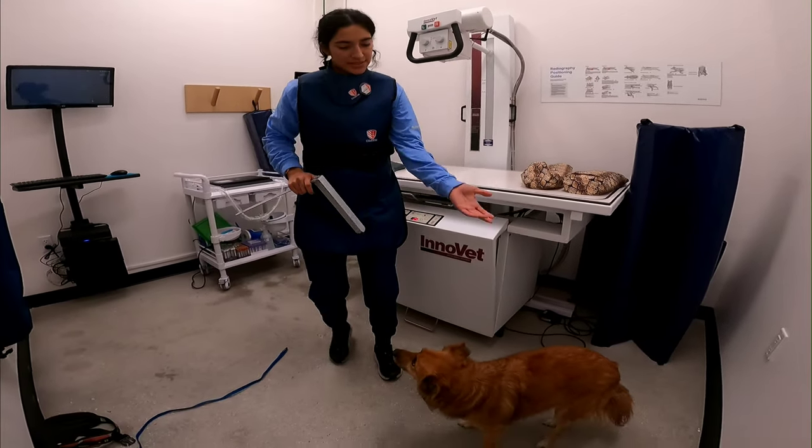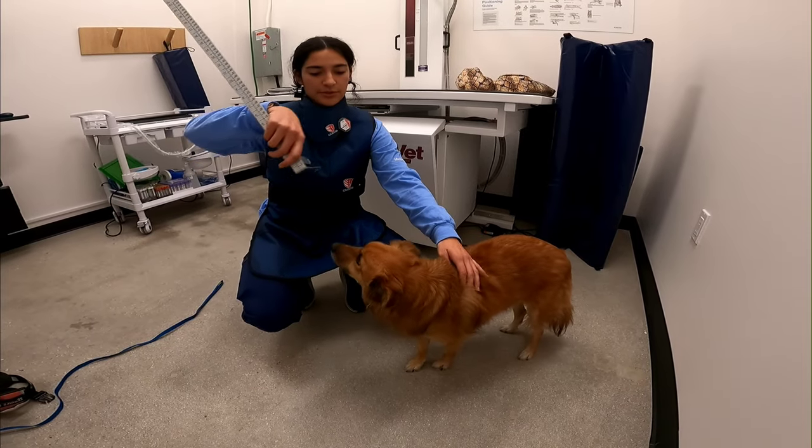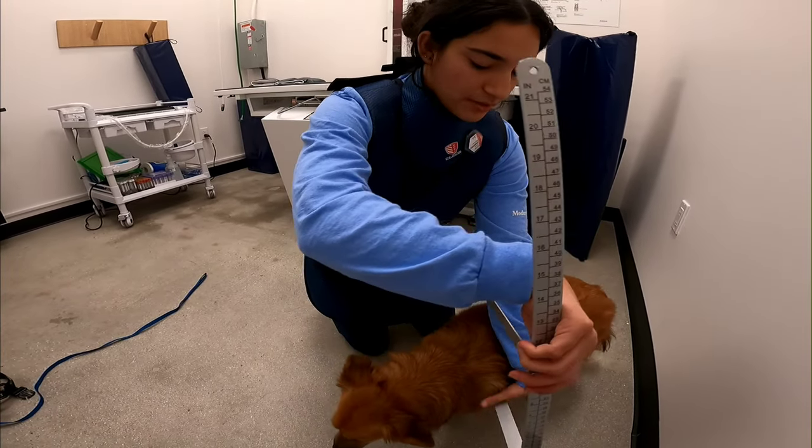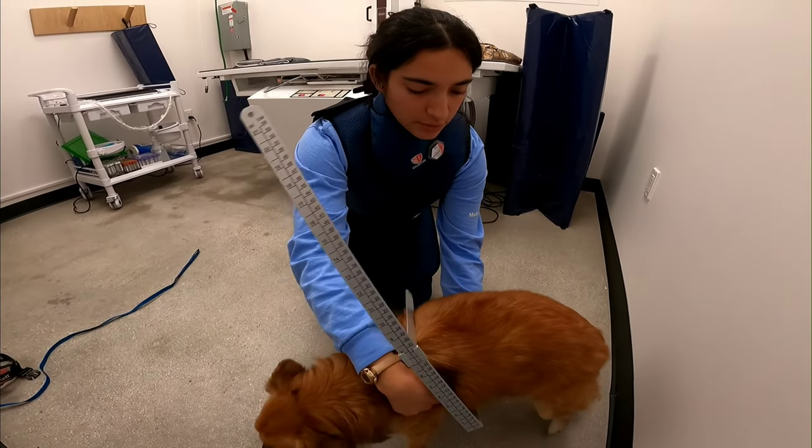This is my patient. We're gonna do chest x-rays. We want to measure the widest part of the desired area. It's scary, and it's coming towards me.